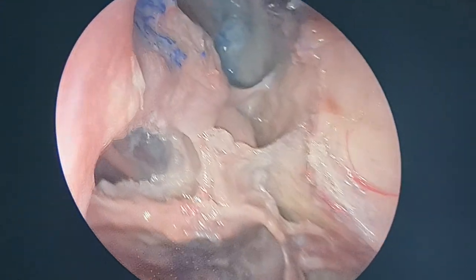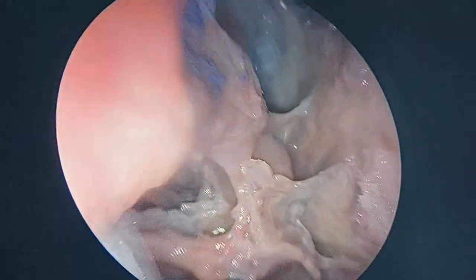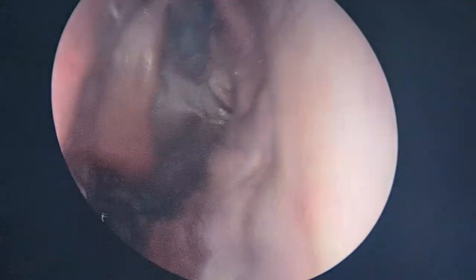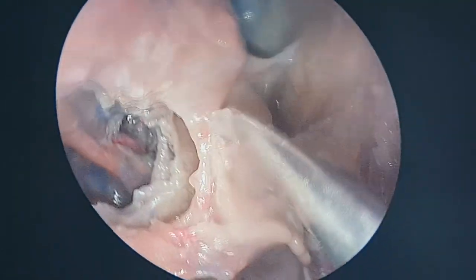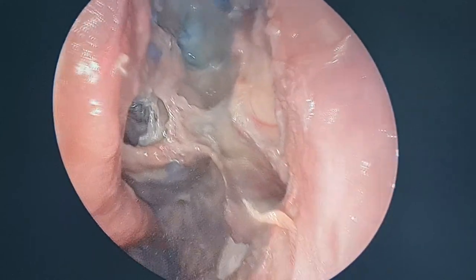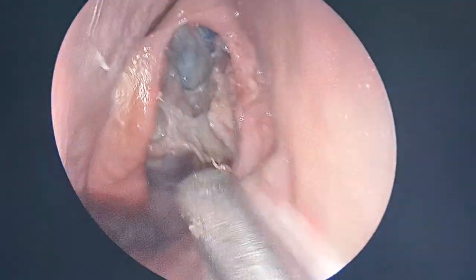Superior turbinate, from this window. Now, what you need to see is what I want to show the fellowship. Yes. This is the superior turbinate, and we know medial to the superior turbinate is the sphenoid ostium. Why am I going medially here before doing it? Why not do the sphenoid ostium first? The reason being, if there is an Onodi cell, if I keep going behind, this cell will take me in the optic nerve direction. I can hit the optic nerve behind it. In spite of any given abnormal anatomy, the optic nerve cannot come anterior to the sphenoid ostium. In any given situation, the optic nerve cannot come anterior to the sphenoid ostium.